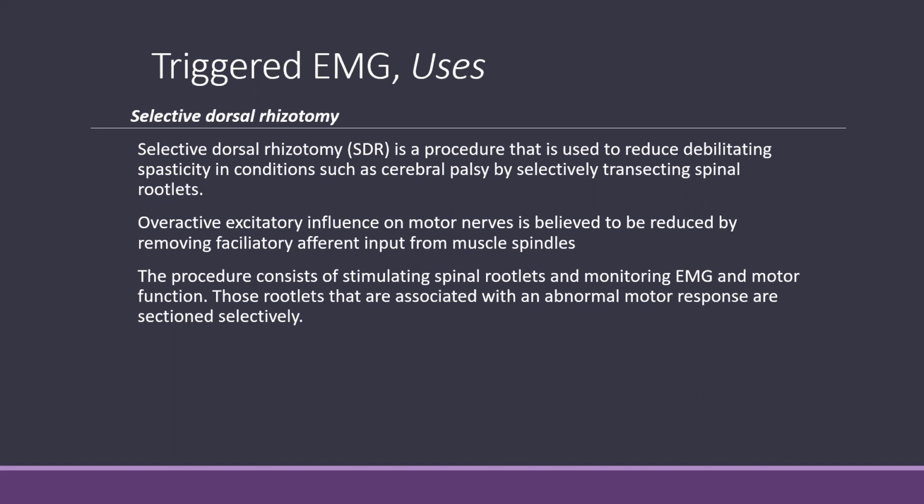These rootlets that are associated with an abnormal motor response are sectioned selectively, ideally treating the spasticity that the patient was painfully experiencing.